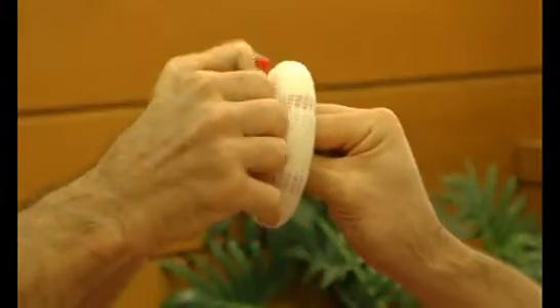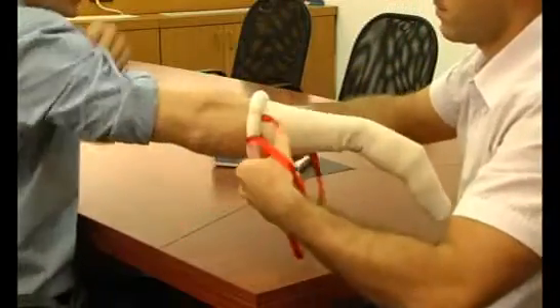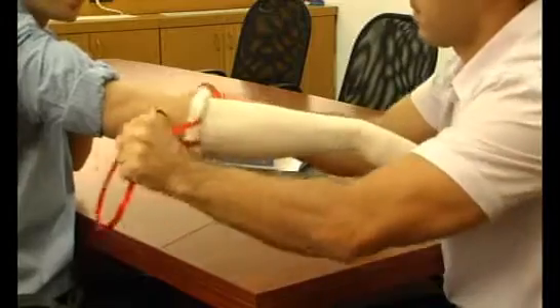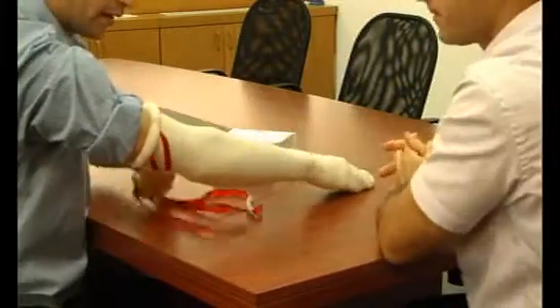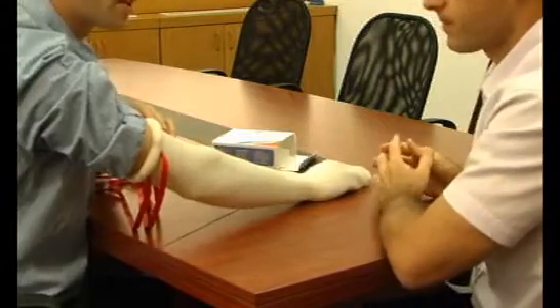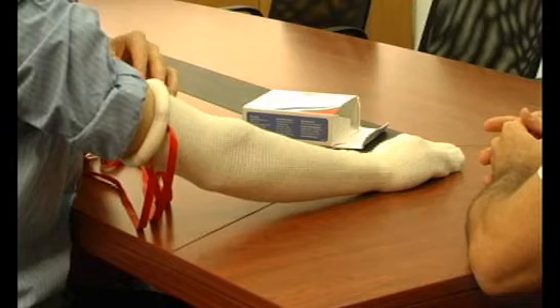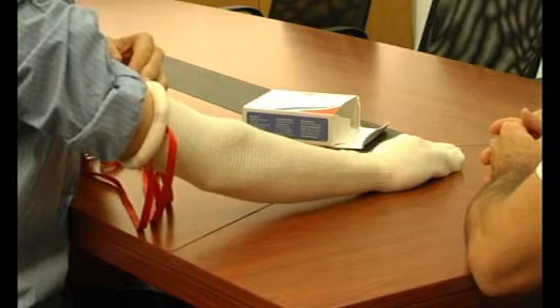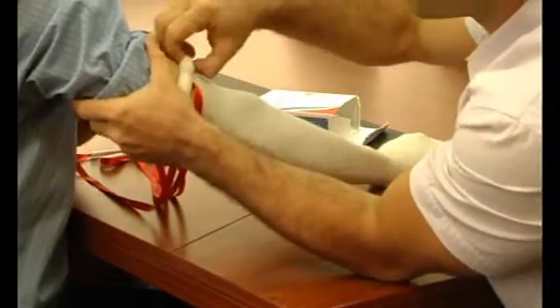It's very easy and very simple. What I need from you — this is the Hemaclear — is to pull these two handles outside and toward me. Like this? Yes. Wait a minute — you can take it all the way up. Okay, you can stop here. Let me take the straps. Let's see what you've done in less than 5 seconds. You have exsanguinated 95% of the blood from the limb. You have occluded my arterial flow. You can feel this is the tourniquet.